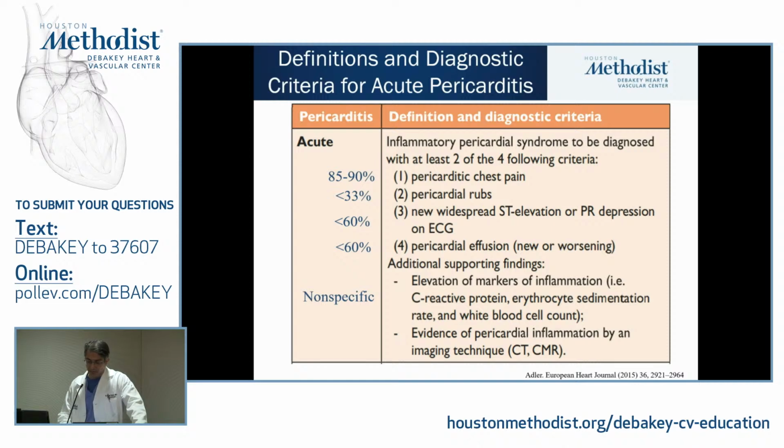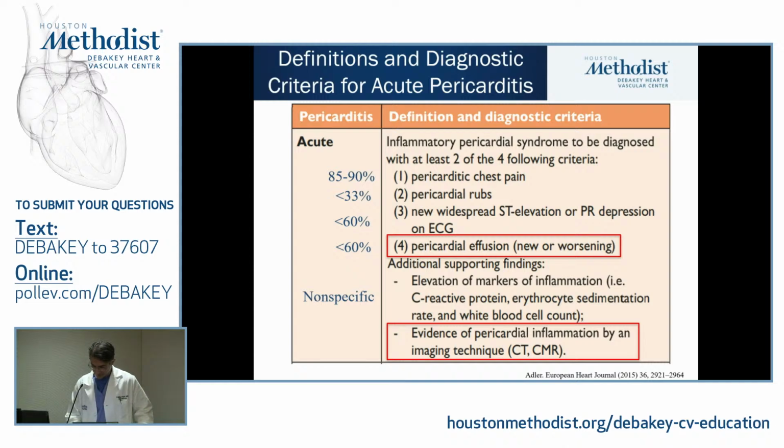So the trick with all of this is that, despite your patient presenting with acute pericarditis, the chances of finding a lot of these findings sometimes can be pretty low.